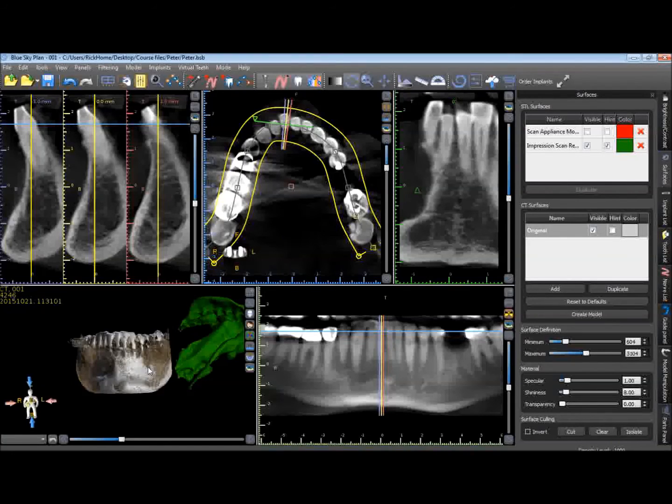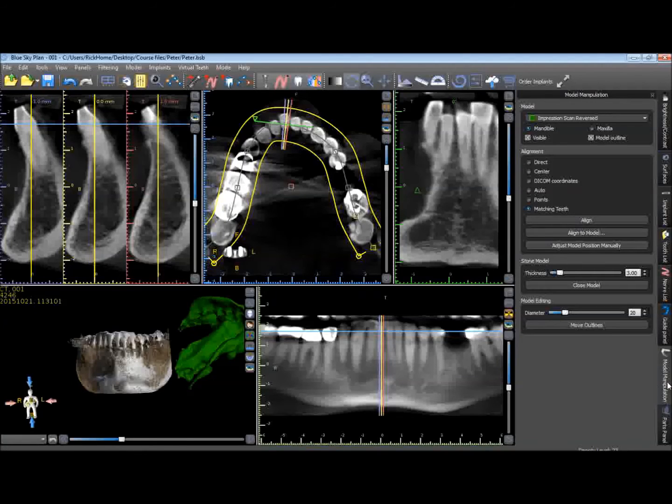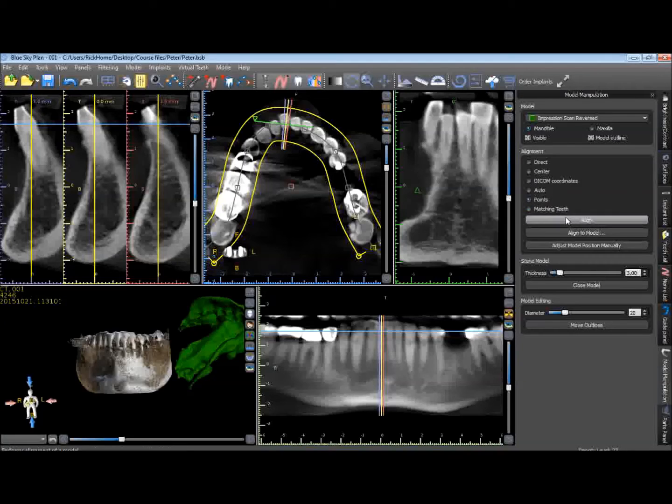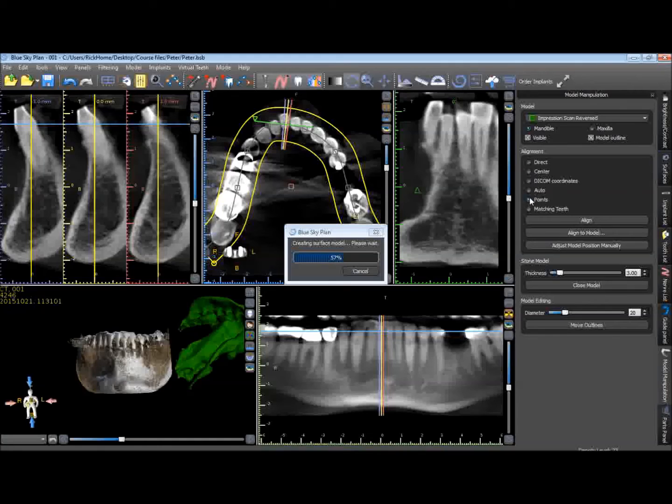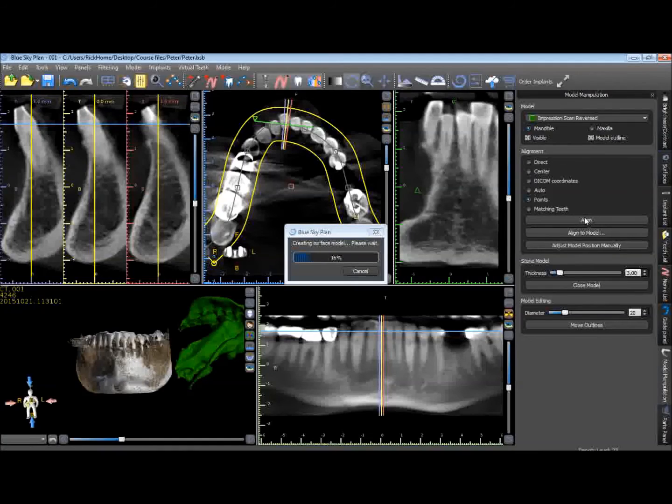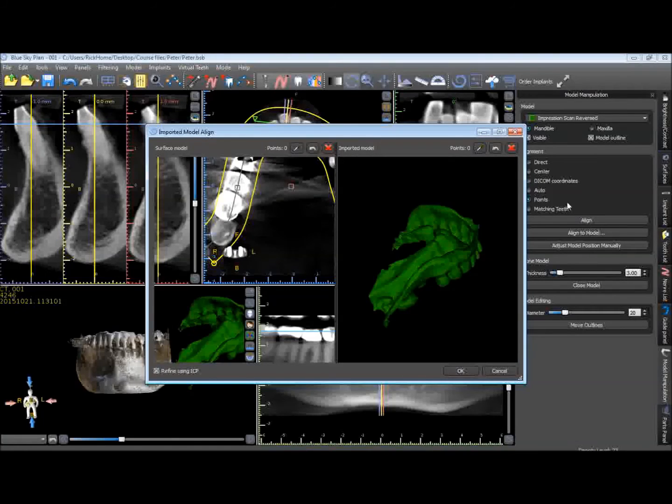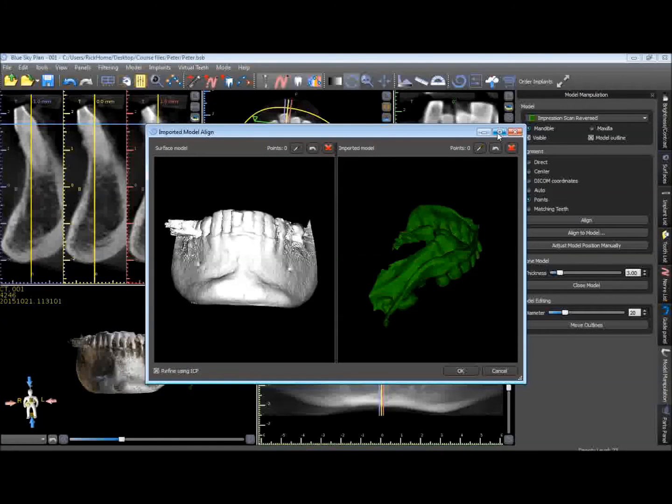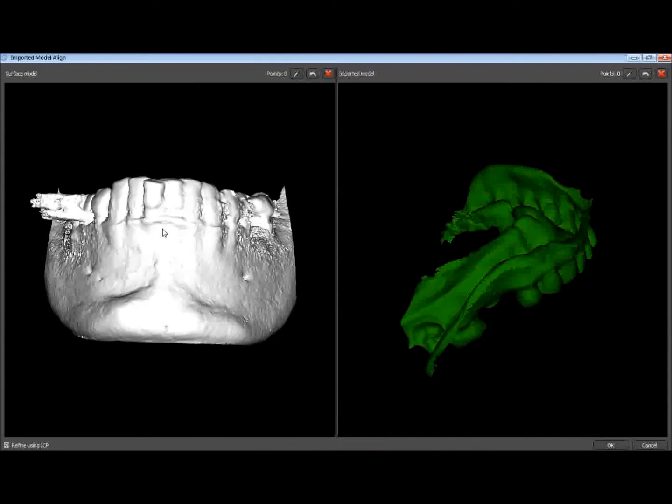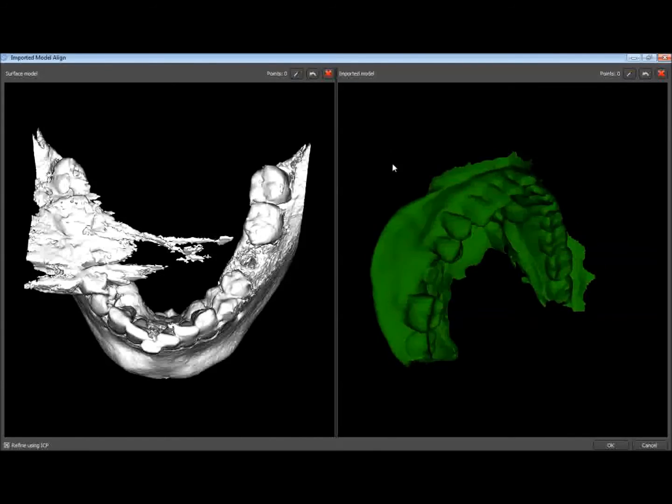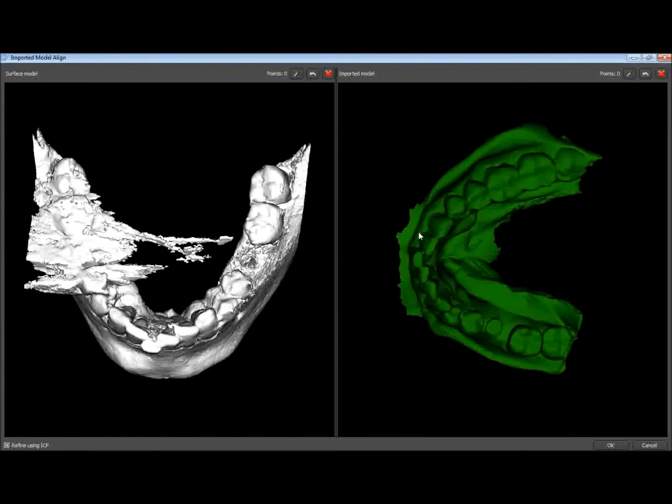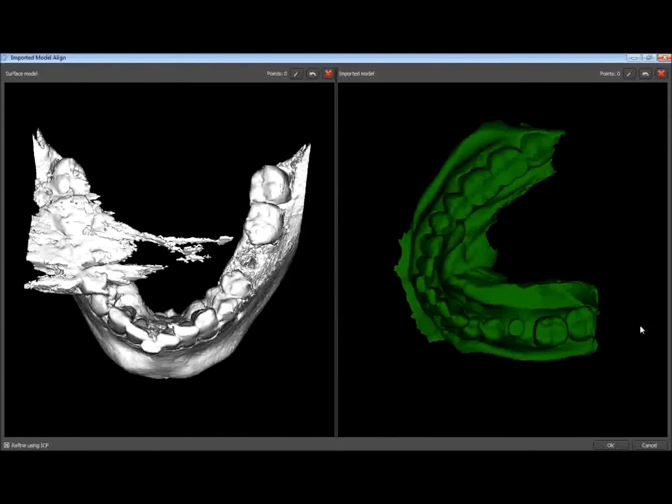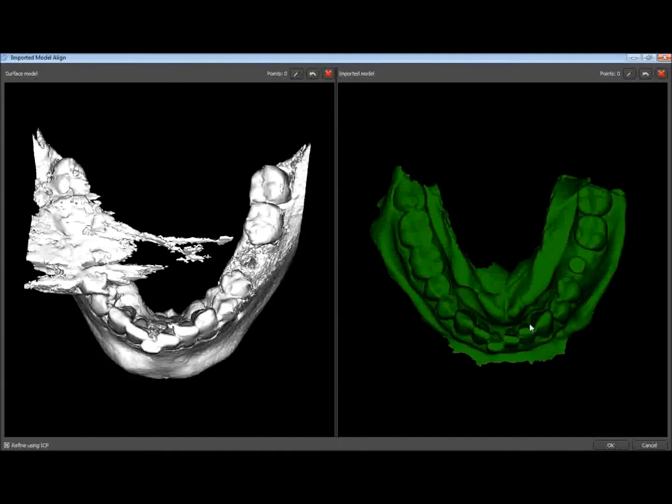It takes a little bit longer, but there we go. And now we can use the model manipulation tool to align. We're going to align these two data sets by points by clicking on the points button here and then align. It's going to create a solid surface model from the jaw scan. And then we'll use the alignment tool by points to align these two data sets. So here is the jaw scan. Here is the impression scan that we reversed in MeshMixer.